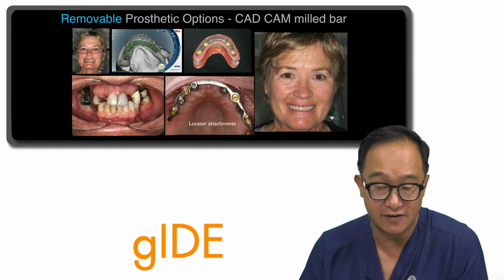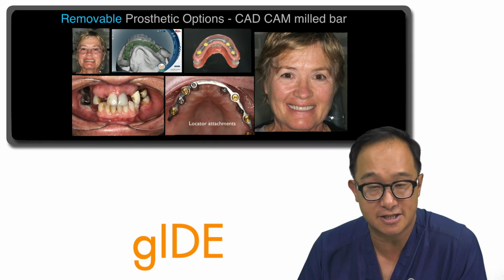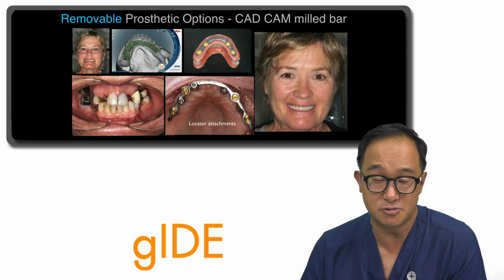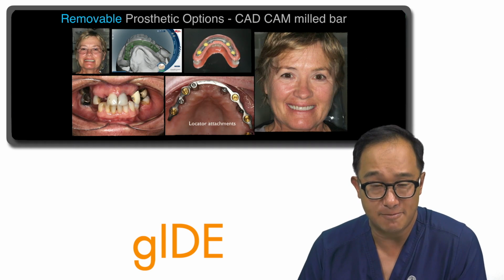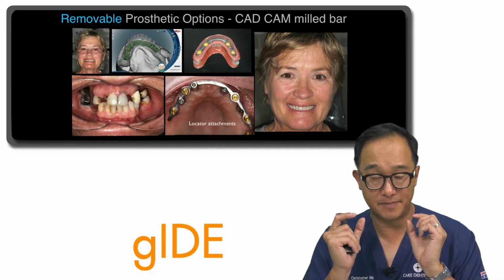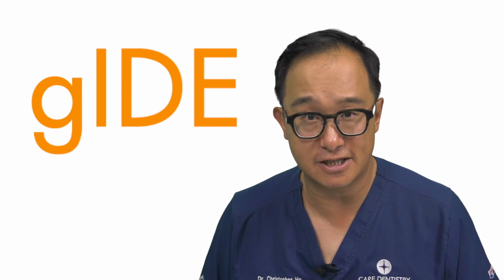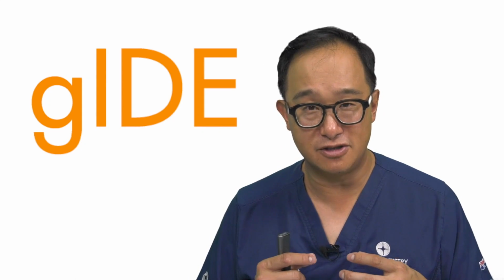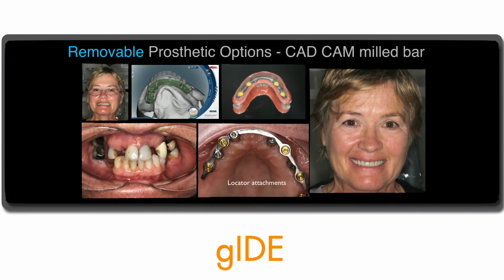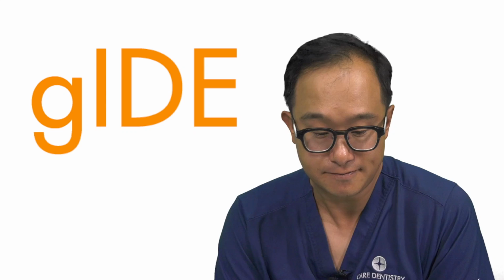A good tip I can give you when you first give these to patients: maybe don't use all the attachments. There are 4 attachments. I sometimes leave out some of the processing attachments and put on 2 or 3 so that the patient gets used to taking them on and off. If you make it too tight for the patient initially, they get very nervous and anxious when they can't take it off. Particularly with elderly patients, they may have difficulty taking things on and off. So get them used to doing this first with less retention, and then increase the retention as required.